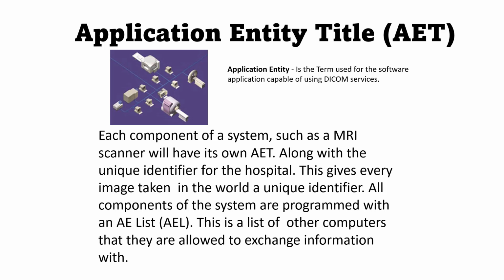The application entity is a term used for the software application capable of using the DICOM services. Each component of a system, such as an MRI scanner, will have its own AET. Along with the unique identifier for the hospital, this gives every image taken in the world a unique identifier. All components of the system are programmed with an AE list, called AEL, and this is a list of the other components that they are allowed to exchange information with.